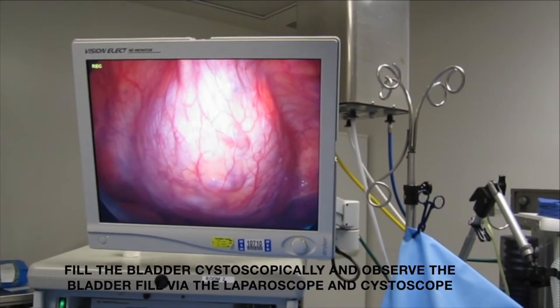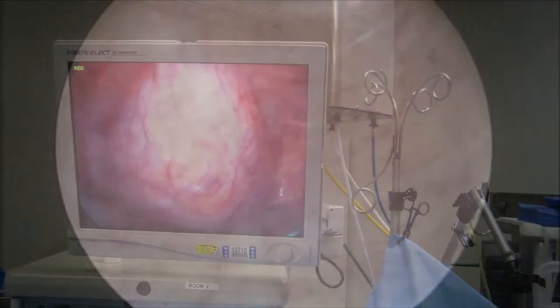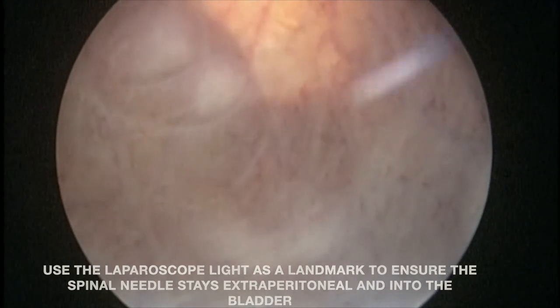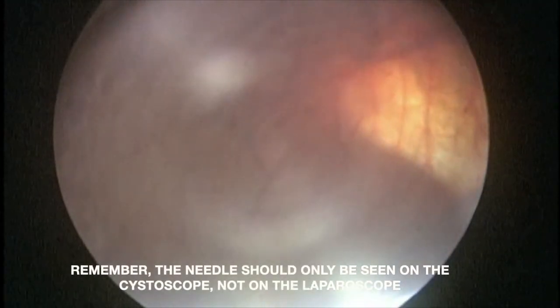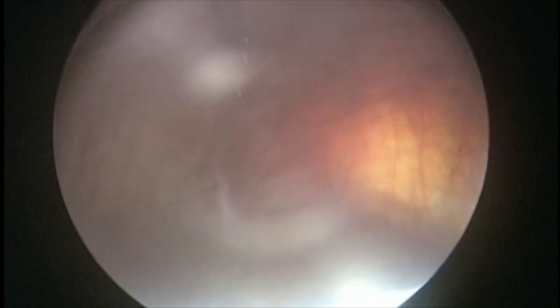Fill the bladder cystoscopically and observe the bladder fill using the laparoscope. Once the bladder is full, use the laparoscope light as a landmark to ensure that the spinal needle you put in stays extraperitoneally. The needle should only be seen in the cystoscope, not the laparoscope.